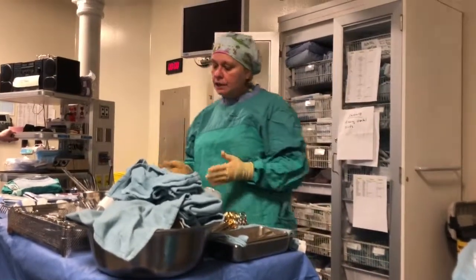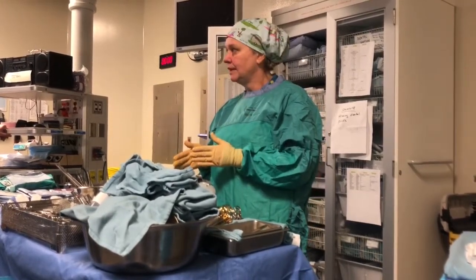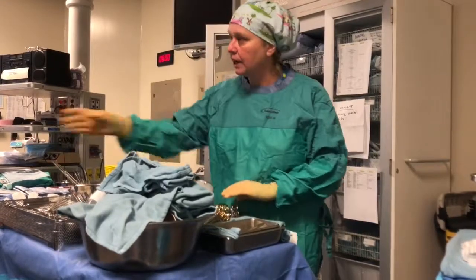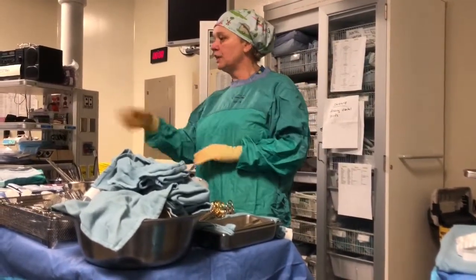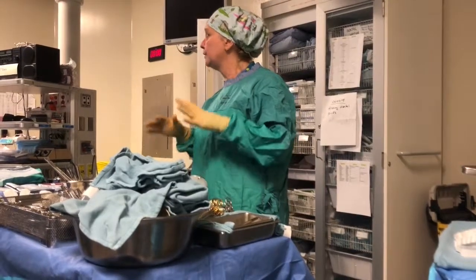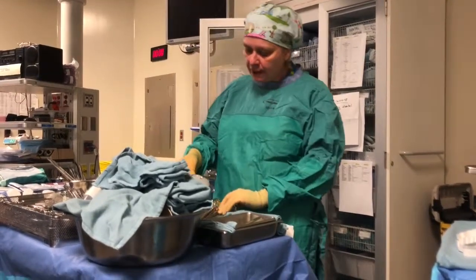Your best thing to do always when you're a scrub nurse is put things back exactly where they came from. Always. Because if you have like 3 snaps here and a couple of things there, then you've got instruments all over the place, and they're going to be close, they're going to be stapling, and you still haven't even finished your count yet, right? So you've got to try to really, really be organized. That is so important, right? Once it's used, you put it back, right?